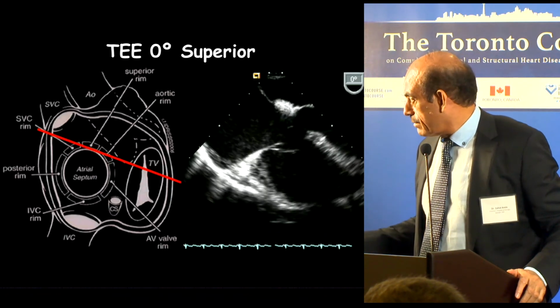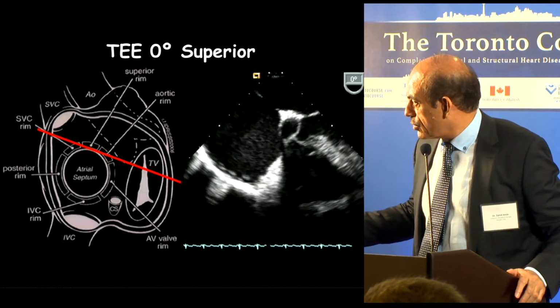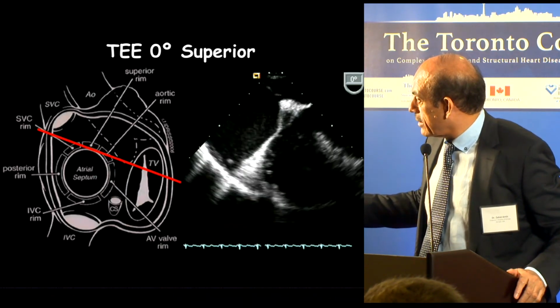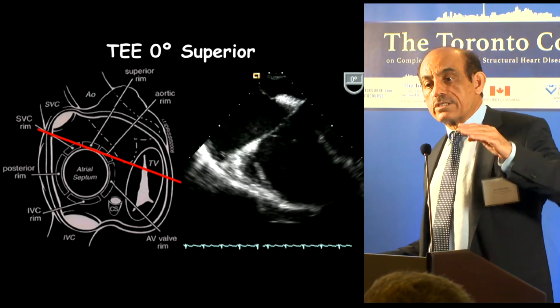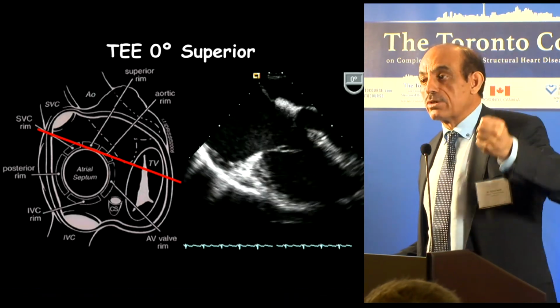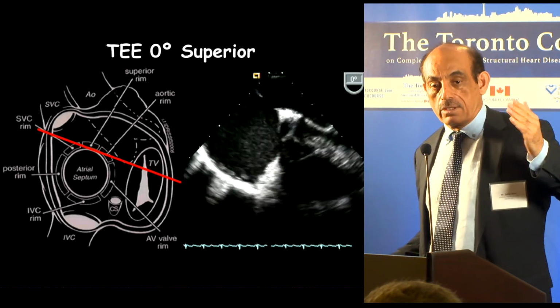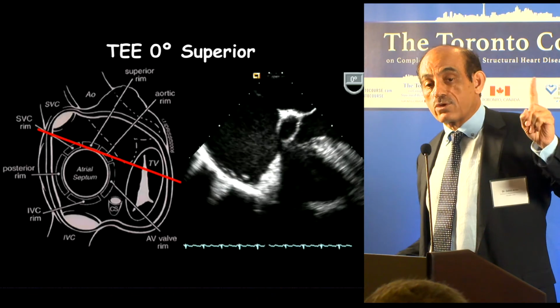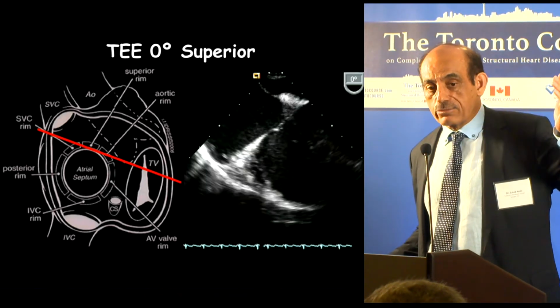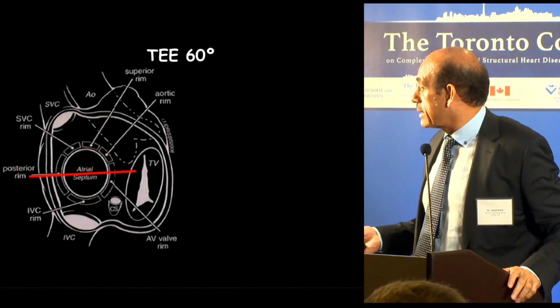And when you pull back, now pay attention to this, right behind is the aorta. You should start seeing the aorta coming into view. So that means you're looking at the anterior-most part of the atrial septum now. So by doing this simple maneuver, you have looked at the AV valve from the mitral-aortic continuity area, not the anatomical thing that I'm talking about, to the backmost part, which is the coronary sinus part of this.